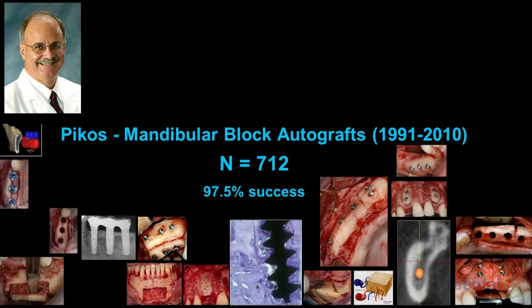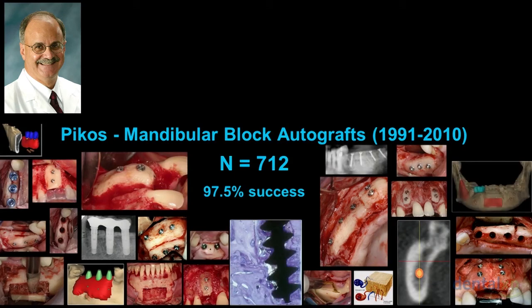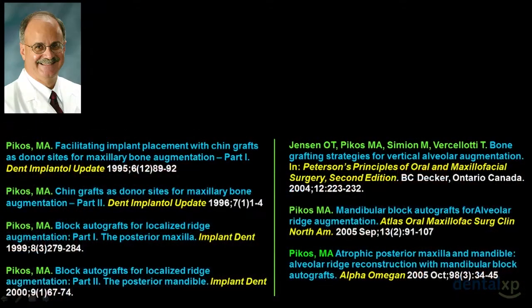And yes, they take some time to turn over, but I will tell you in 4 months, we'll re-enter this site and have D2 quality bone, even D1 bone, because the bone density is taken to that site from the donor bone itself. In other words, we're transplanting from here to here. There's no question, is it a mineralized matrix? Is it bone? It is bone. We know that. There's no question.